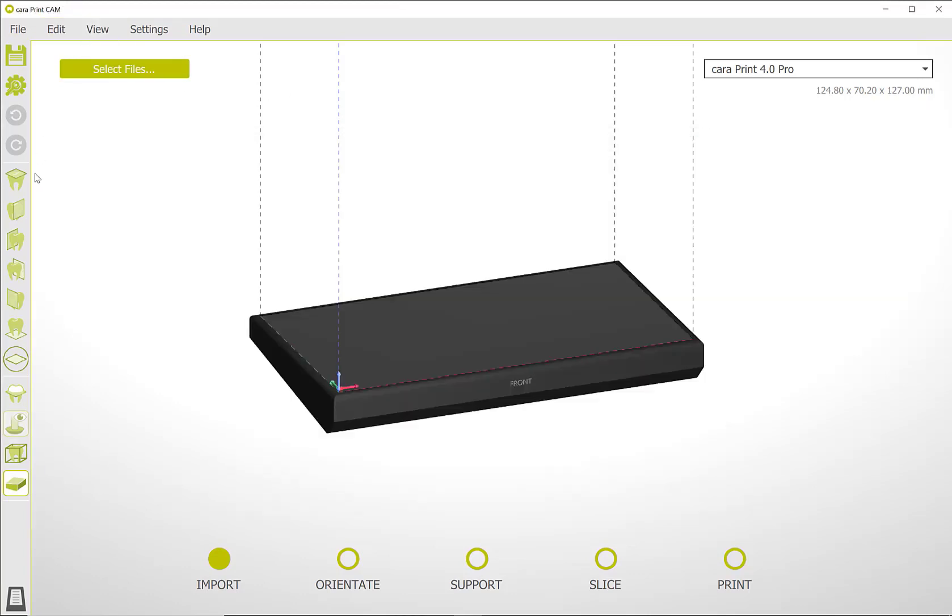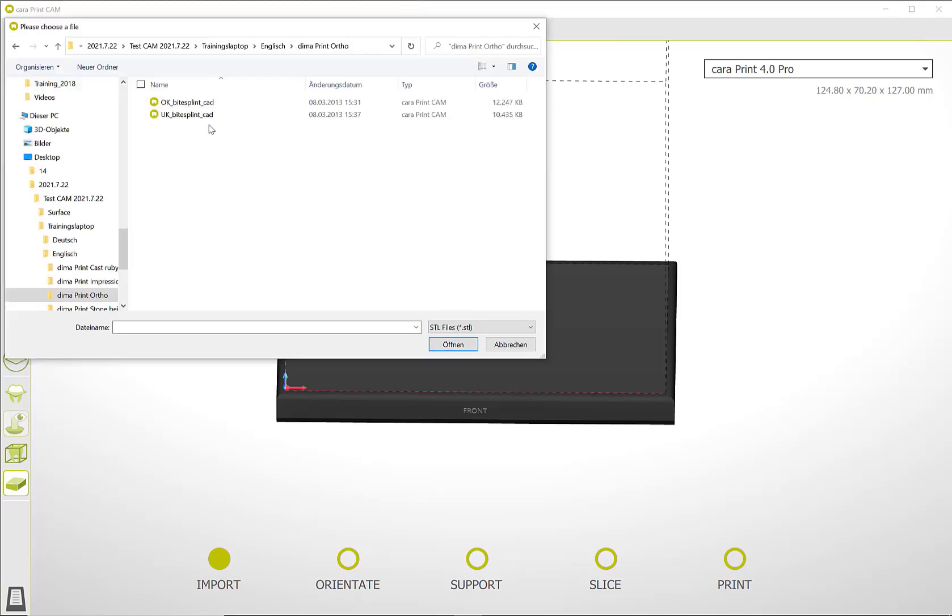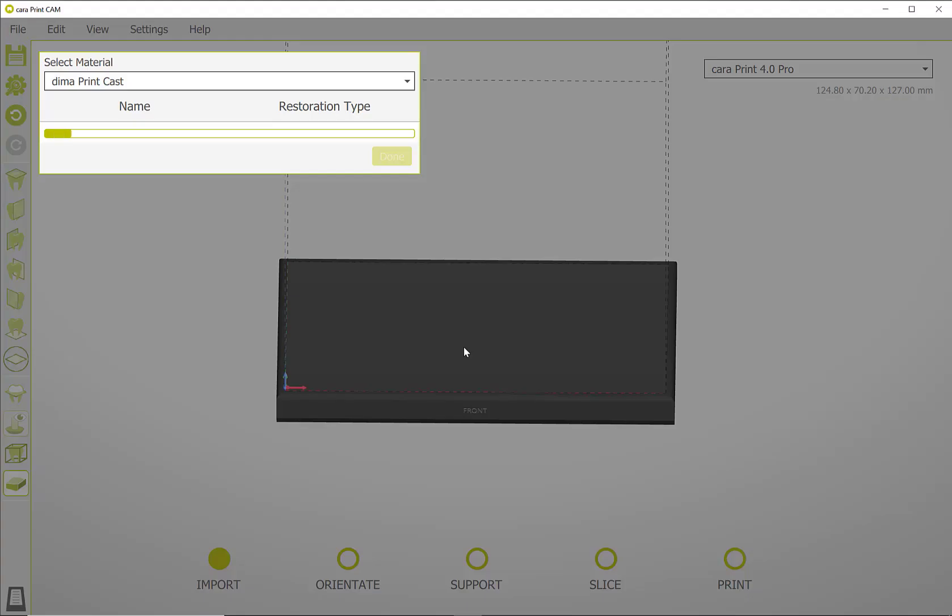For an ideal overview in the complete workflow, the build platform can be shown or hidden at any time. Use the Select File button to start a new case. Here you can select the corresponding file from your memory and load it for editing.